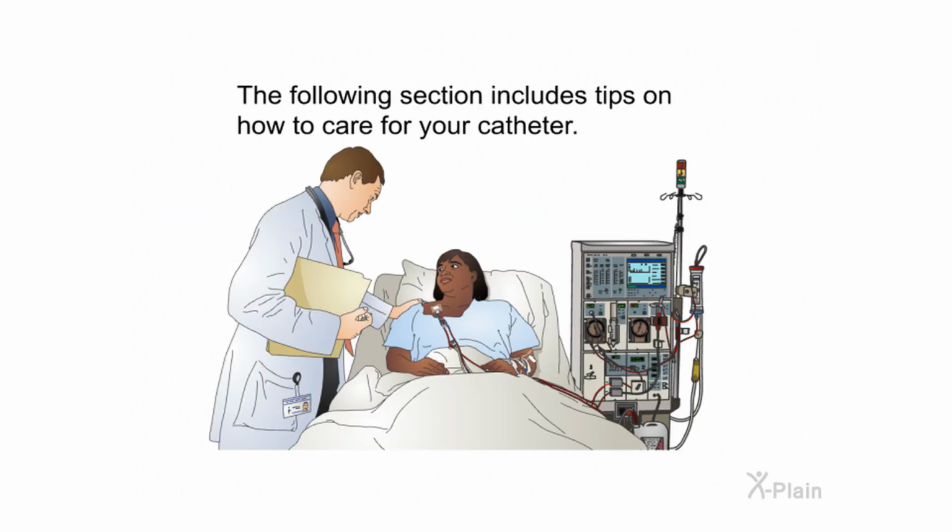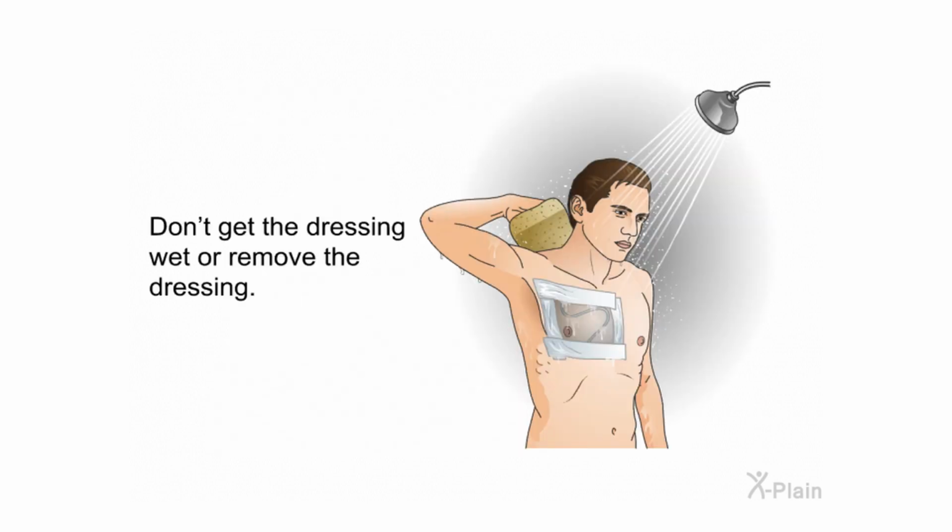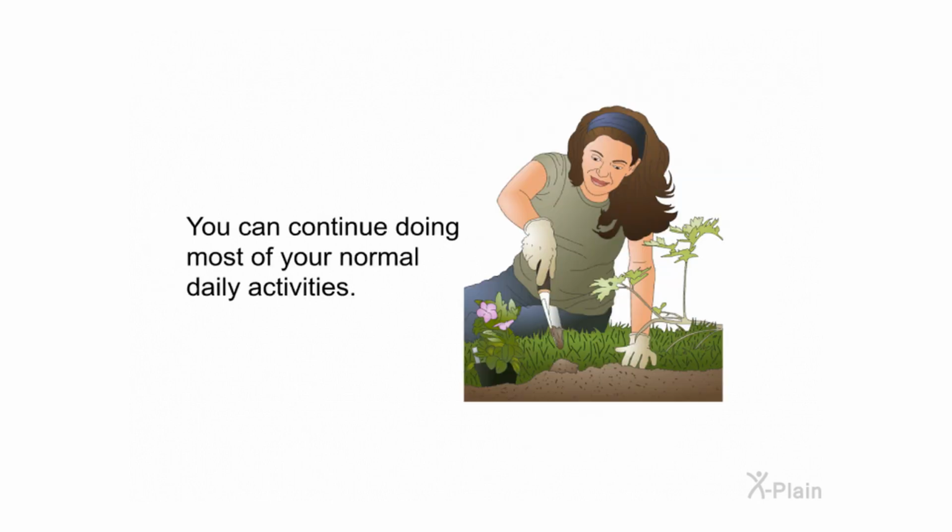How to care for your catheter. The following section includes tips on how to care for your catheter. Don't get the dressing wet or remove the dressing. You can continue doing most of your normal daily activities.